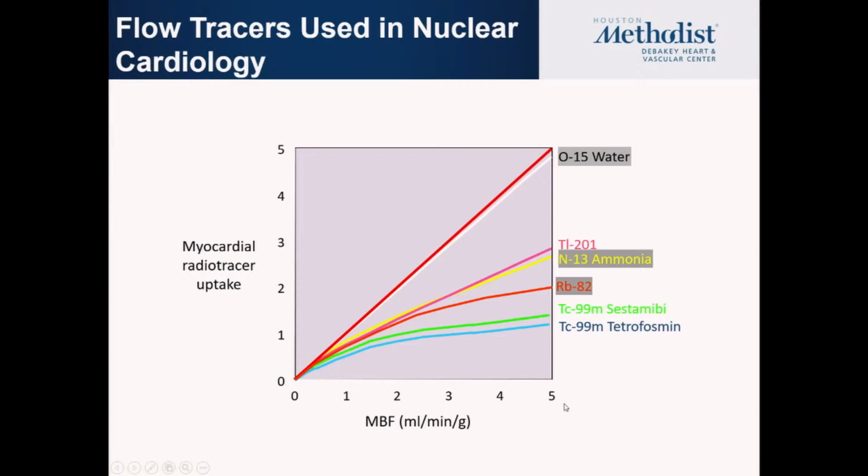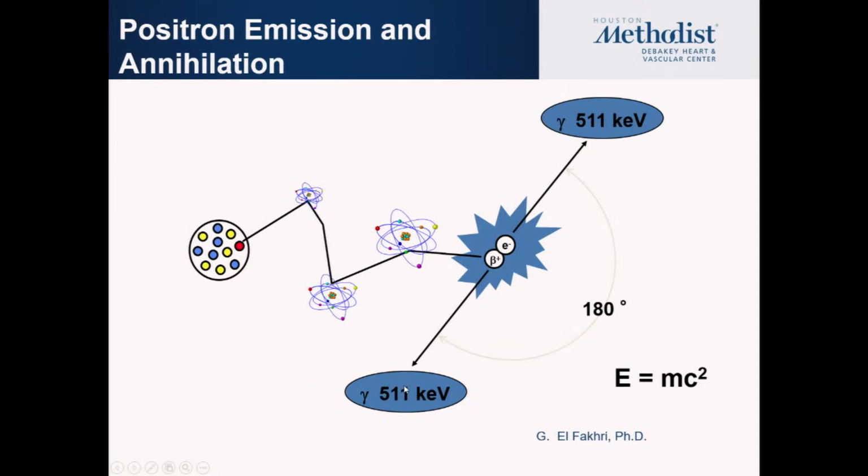So you tend not to be able to see a drop in flow until you start to get into a more significant reduction in myocardial blood flow with significant lesions. So you cannot detect the difference of a lesion that reduces the flow from 5 to 3, but you might detect it if it goes from 3 to 1. And these are typically the more significant lesions.